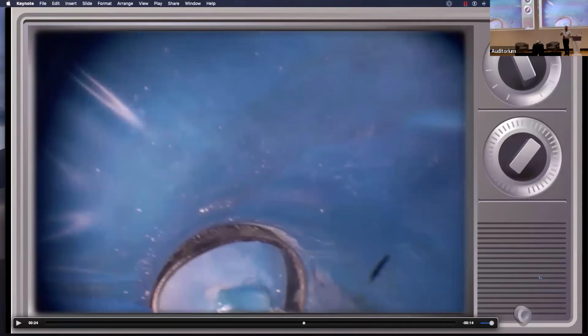So the ML canal, the biggest file it saw to full length was a 1702, actually took a 2006 cone because of the natural shape and size in that canal. We didn't put that shape in there, that was there naturally. So you end up having to sort through the cones and sometimes trim some cones, which we're all used to doing, to get them to fit. Because you're kind of fitting the cone at these smaller sizes, to some degree to the natural shape that was in the canal.